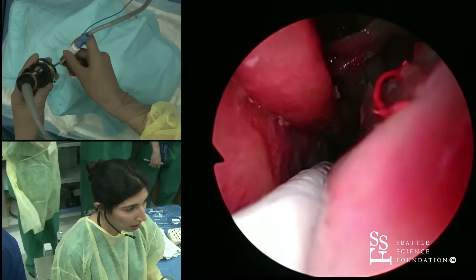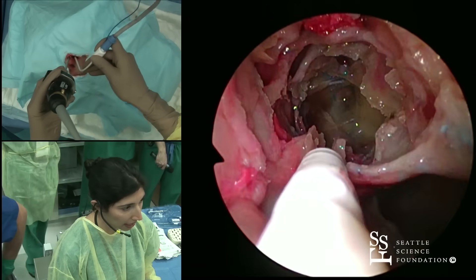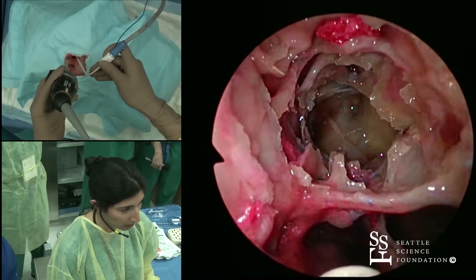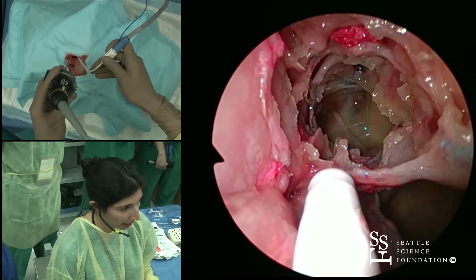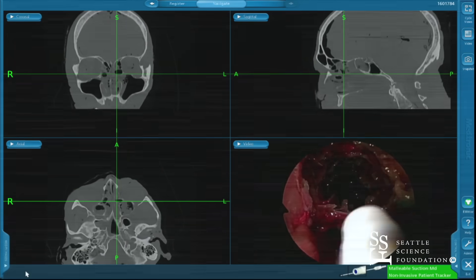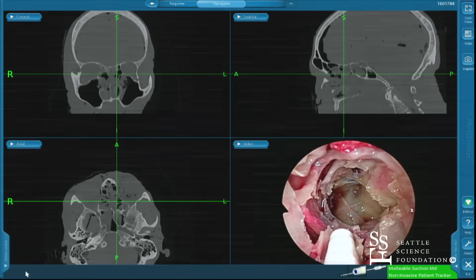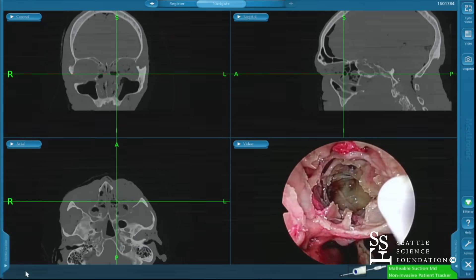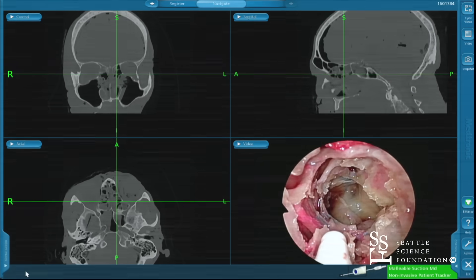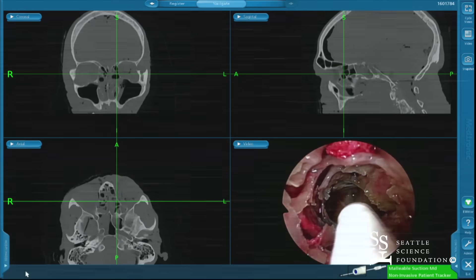We're going to look in again. Rick and Andy have already done a lot of my work for me, but we can take a look back. Here's the basal lamella of the middle turbinate, and we've gone through it to go into the posterior ethmoids. When I'm doing my sphenoid in a regular case, I tend to clear out a lot of this right by the lamina, but I don't necessarily go all the way back to the sphenoid face before opening up my sphenoid, because getting out the skull base in my sphenoid allows me to come up the skull base a little bit easier.